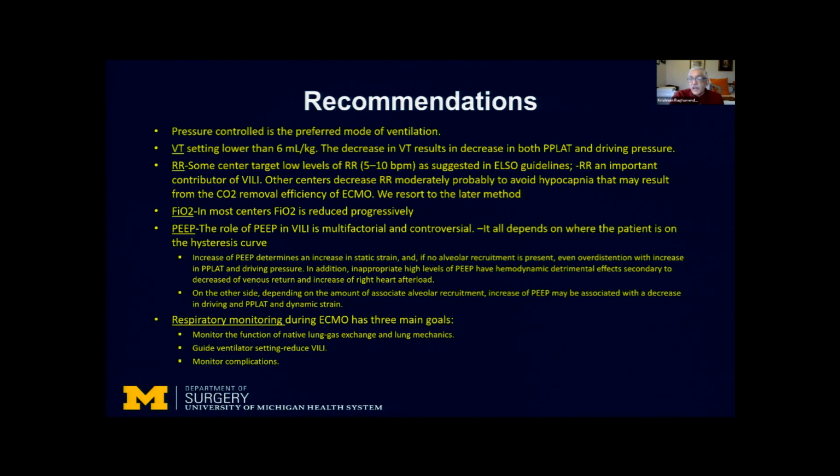They will range anywhere from 10 to 20 as suggested by the Joliard study. And more importantly, we take a very acute look at the effects of PEEP on the venous return. And if necessary, we keep the volumes up so that the ECMO circuit does not keep chugging all the time. And so one of the ways we adjust PEEP is not just for the oxygenation, but for mechanics of the lung and the effect on venous return.